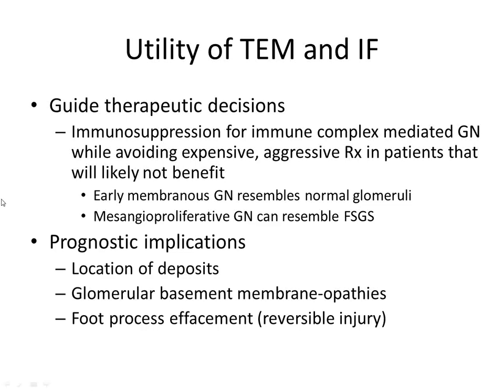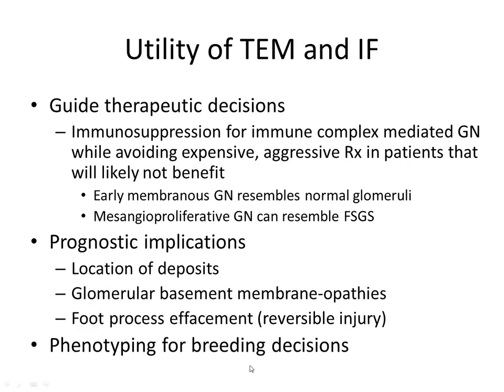And let me throw in that in the review that we did, 500 cases of suspected canine glomerular disease from North America, in round numbers, 25% of those cases required EM and/or IF to either prove immune complexes that were suspected or even unsuspected but nonetheless present, or disprove them sometimes when they were called on the basis of light microscopy or at least suspected.